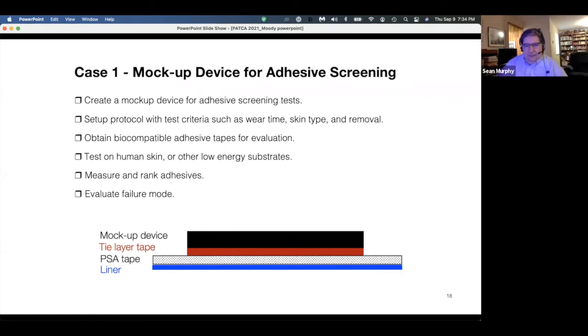For example, there are mechanical testing labs that will do things like UL certification. They'll do drop tests. Are there equivalent standards for different categories of these wearable devices that are attached with adhesive? There are certain standards for this, and they're similar to regular ones, but there are some other standards as well. Are there labs that provide specialized testing? Yes, there are labs that do that as well.